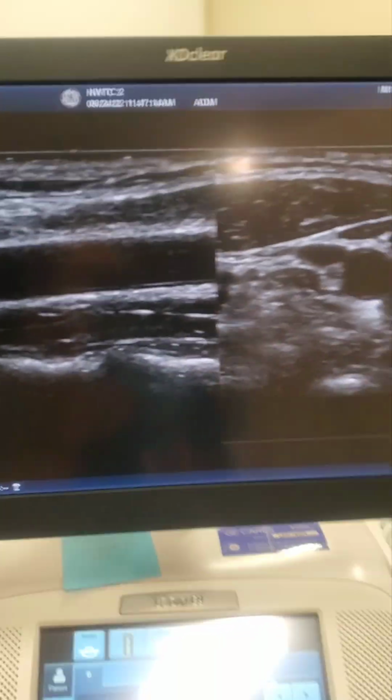The 4th dimension is time. Ultrasound is unique in that we can scan in real time. I can look at the blood flowing through that carotid artery and I can measure how fast it's traveling. I can look at a vein and I can see the valve as it flaps. You can scan babies in utero and scan in 4D and get a little clip of them doing flips because they like to move in there.